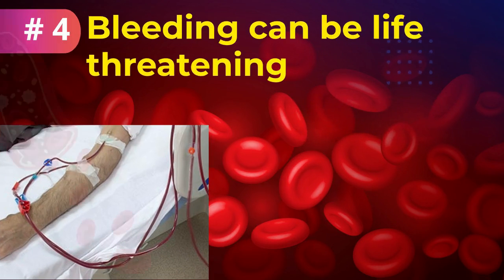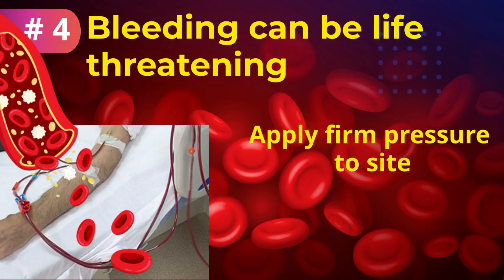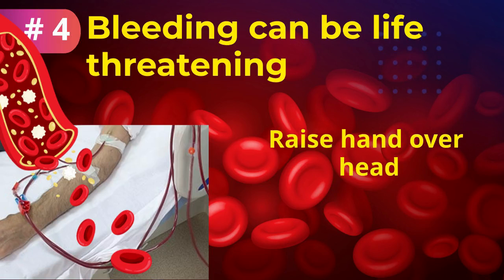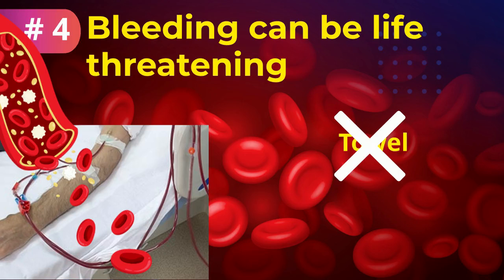AV access hemorrhage can be life-threatening. Patients are taught to remain calm, apply firm pressure to site, raise hand overhead if possible, and call for emergency assistance. Application of towel is discouraged as it can pull more blood.